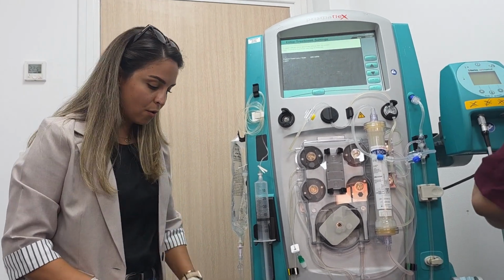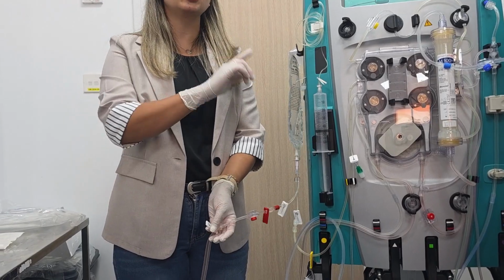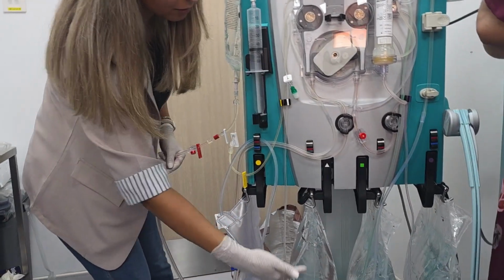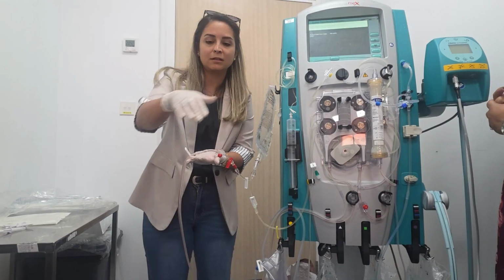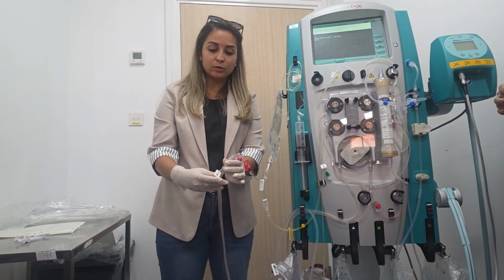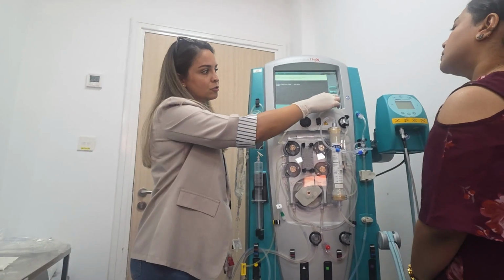Or let's say this clamp was closed, and the machine is giving me a flow problem alarm. I keep checking here, there is no problem, but I am not checking this one, because mostly you can't see it, as it's under the sheet of the patient. So that's why I always make sure this one is open. So what do we do here? Nothing. Just confirm.